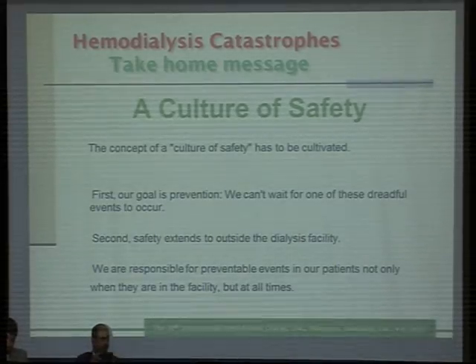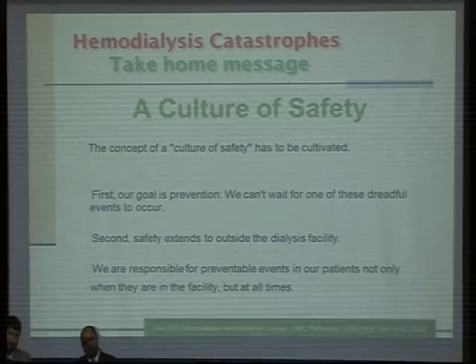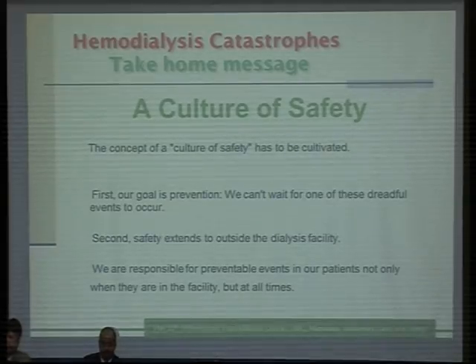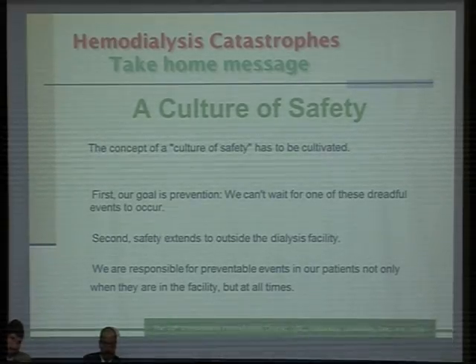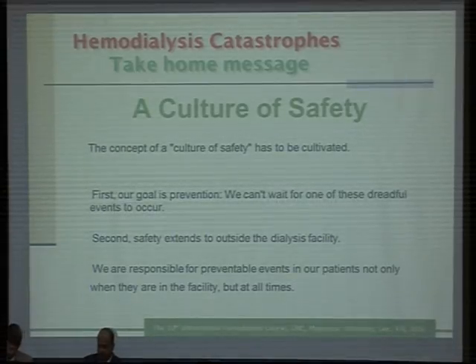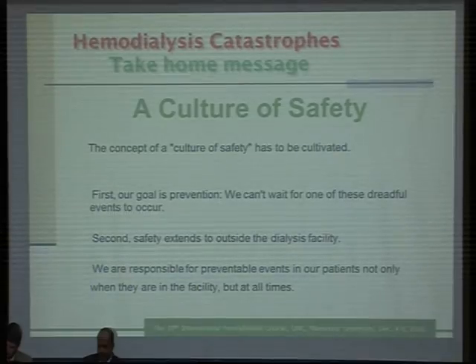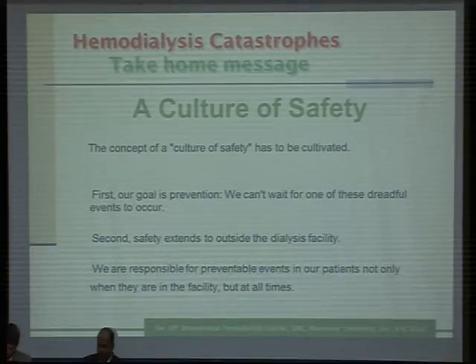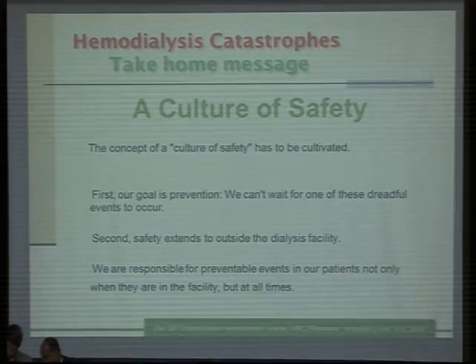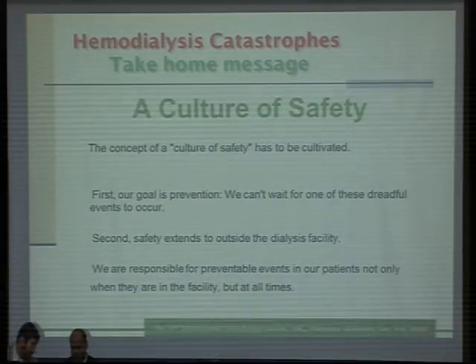Another point, to complete the culture of safety: every unit must have its own policies and procedures. Policies regarding how to disinfect the machine, how to disinfect the water treatment, how to collect the water samples, what is the frequency of monitoring the water treatment, the vaccination program. Every aspect in the dialysis unit must be written as policy and procedure.